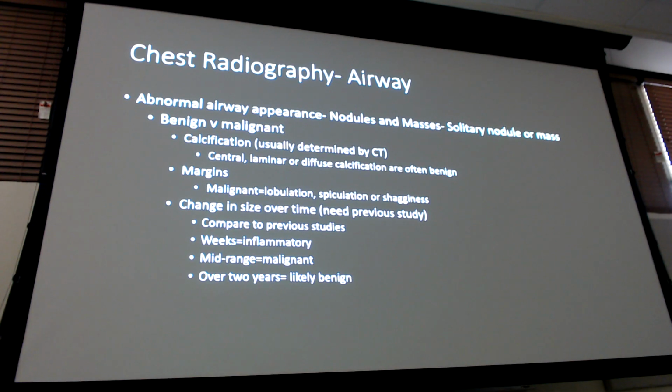So if you get an x-ray and there's something on there, and then say you have them come back for a week or 10-day follow-up or 2-week follow-up or whatever, and you get it again, and all of a sudden that mass has grown in that short period of time, it's an inflammatory process. Cancers don't grow that fast. But your mid-range, coming back in a couple of months and it gets a centimeter or a centimeter and a half bigger or something like that, that's when we start getting concerned. And your benign ones, pretty much, it takes like 2 years to notice a size difference. They grow very, very slowly.